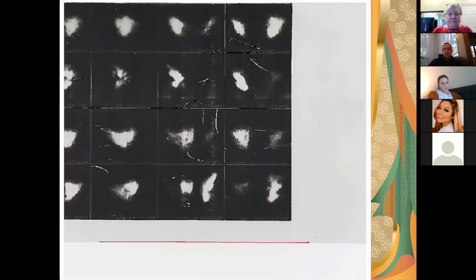So this is one. Now, right here, this is not the ventilatory. This is the perfusion side. So this one's here, not this side, because this is a lateral, so it's only going to show one lung. But these right here are the two lungs. So look, this lung picked up the isotope, but this lung did not.